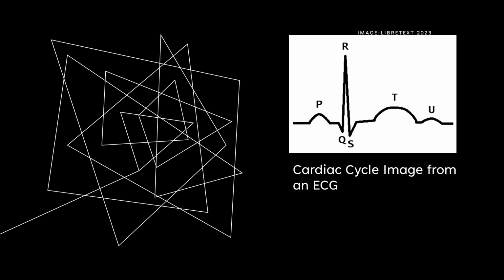When all normal waves are missing, ventricular fibrillation is occurring. What you see is rapid and irregular heartbeats that could quickly cause cardiac death unless electrical resuscitation, like an AED, is utilized immediately. This occurs with myocardial infarctions and heart failure.